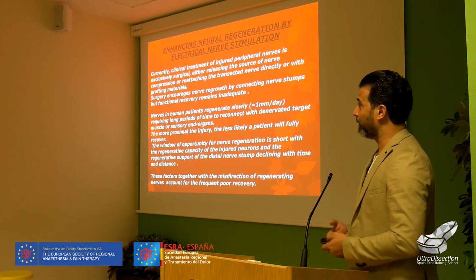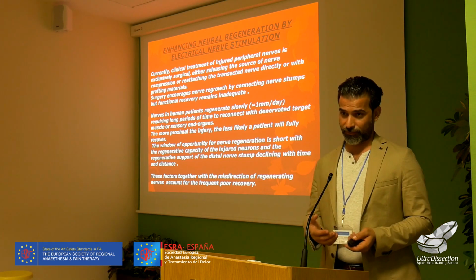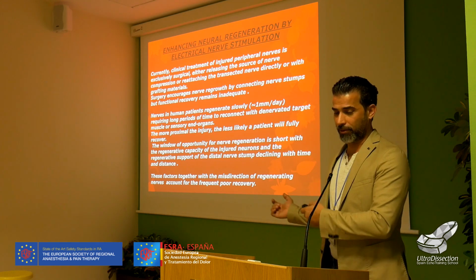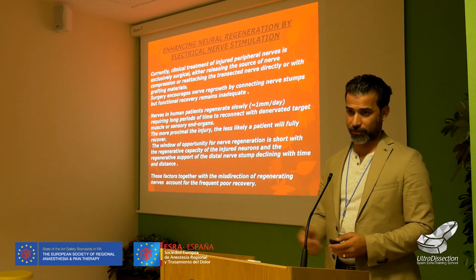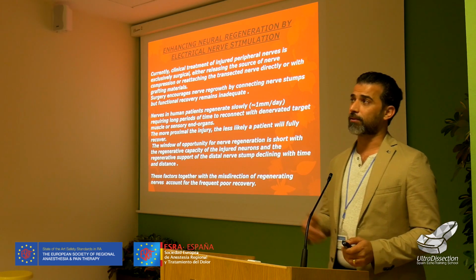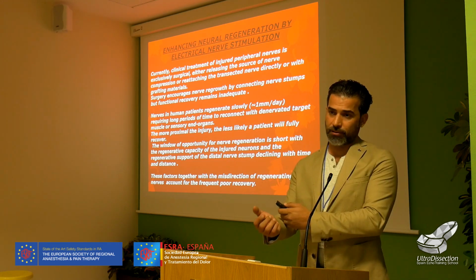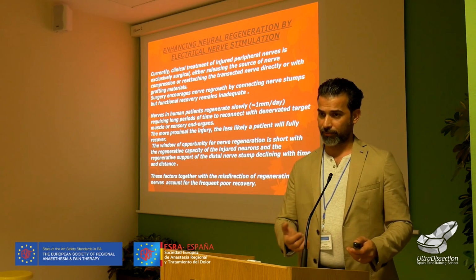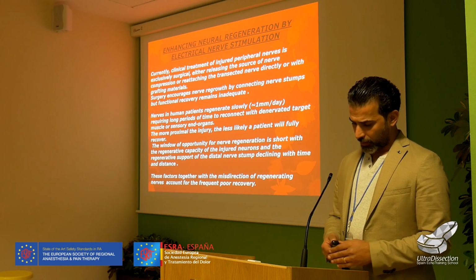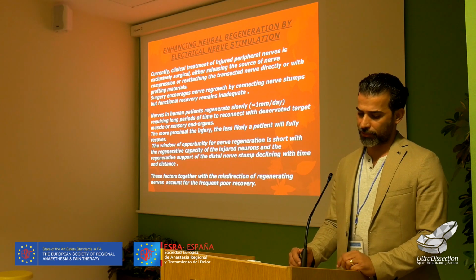We are talking now about nerve electrical stimulation and pulse radiofrequency, what I did in all these videos to get functional recovery. Some patients have immediate functional recovery, and some of them need 3 weeks to 2 months for the reinnervation of the atrophied muscles to regain them. So here we'll talk about enhancing neural regeneration by electrical nerve stimulation.